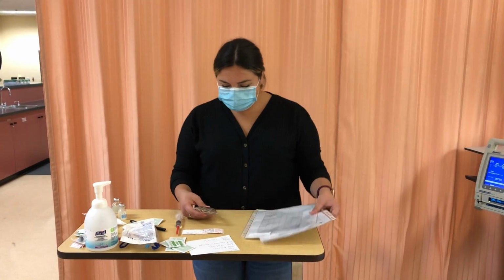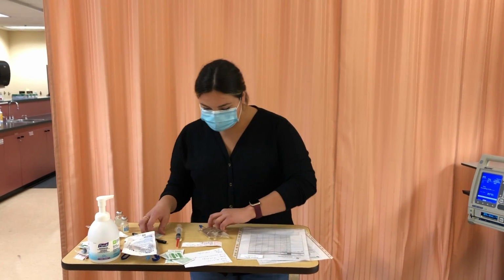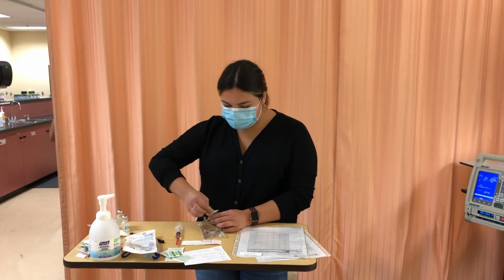So as per PDM, I have a 50 ml bag of normal saline. So I'm just going to clean the end of this.